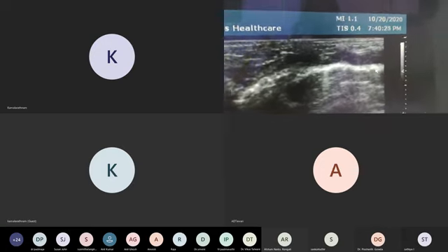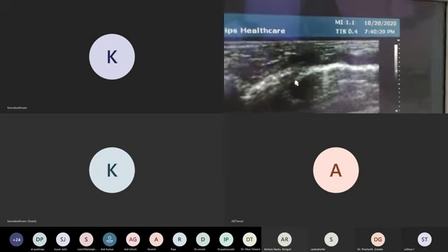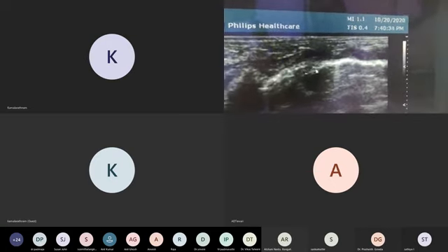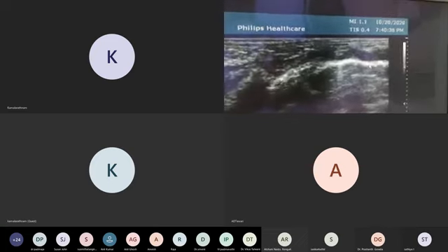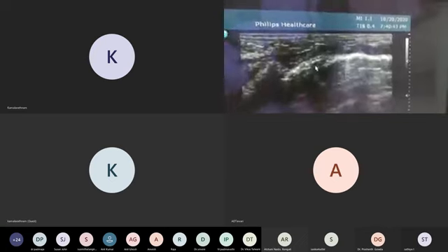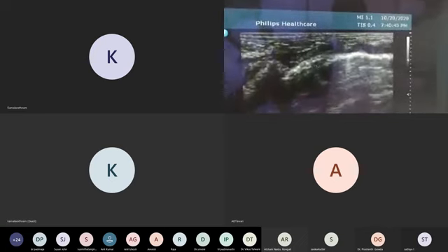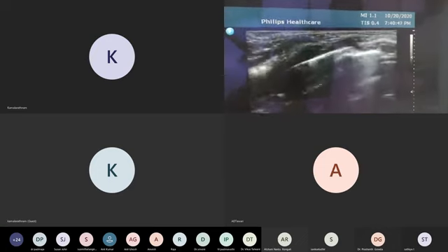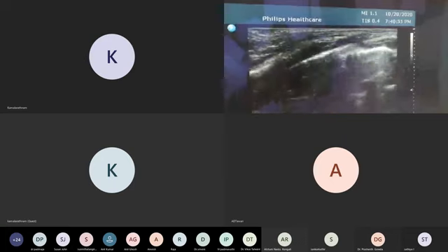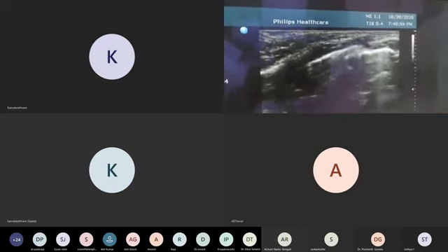See here the pleura. And see, this pleura is a little distorted. That means here I have not kept it perpendicularly. Here I kept it perpendicularly. If you persist, then you go to this area and please be like that. I'll go to that area and I'll show you how beautiful that pleura is. See here. See this area, the pleura, I kept it perpendicular here, but here it's not perpendicular because it is a curvature.